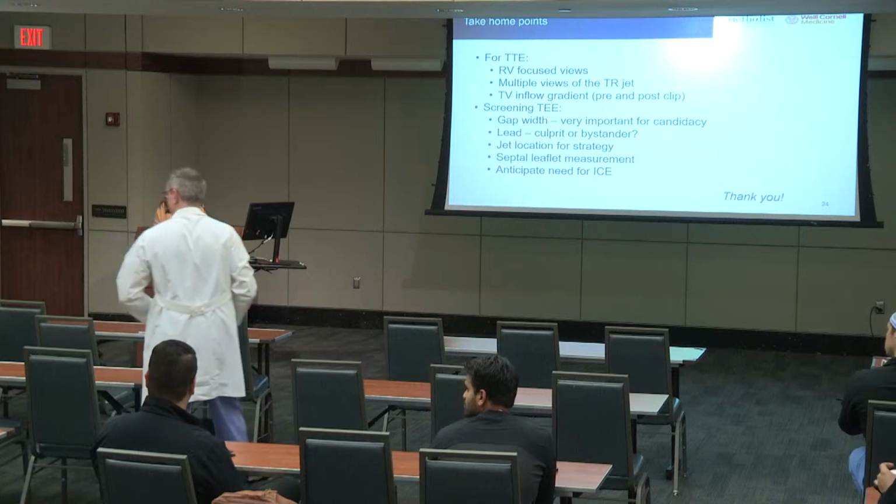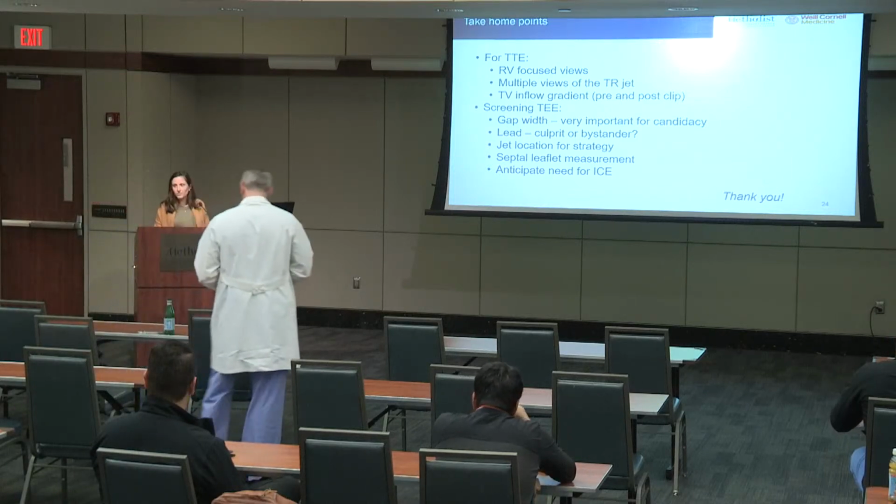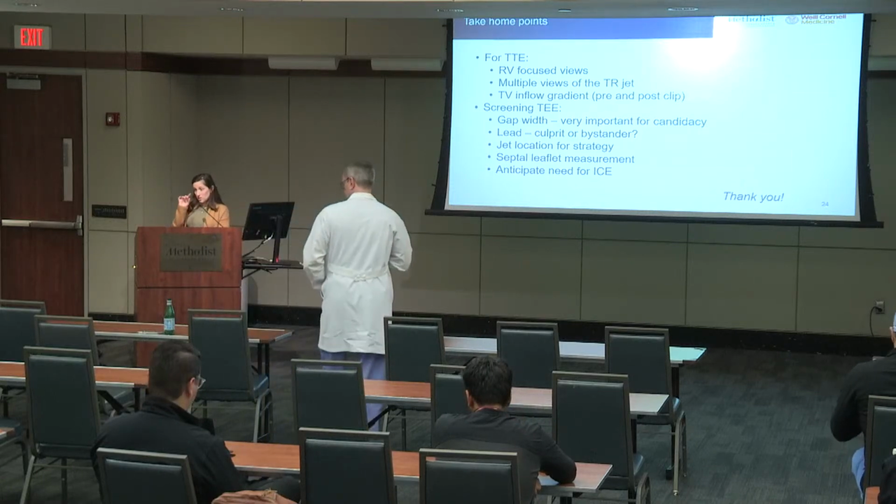Why do you switch between ICE and TE? What's the reason to switch between an ICE and a TE, and are they on the same console? Give us a feel for that. I can take that one.